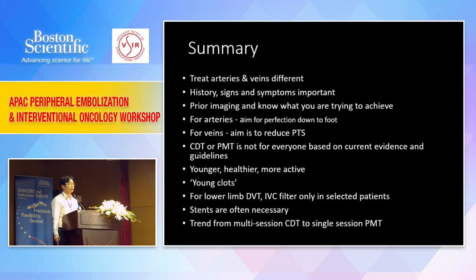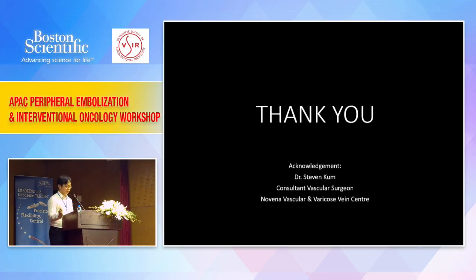Stents are often necessary, whether it's for the arteries or the venous side, and the trend is therefore now from a multi-session catheter-directed thrombolysis to a single-session treatment. Thank you very much.